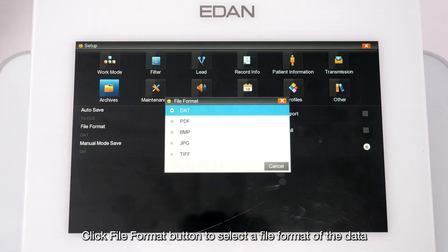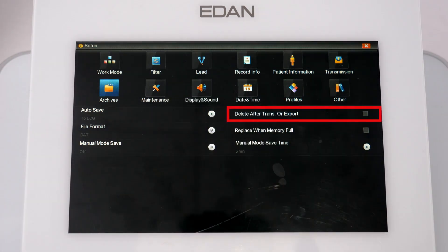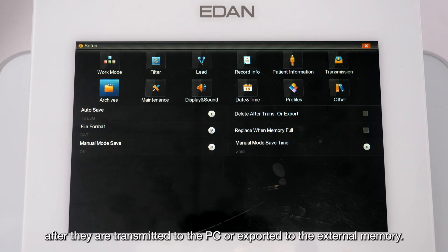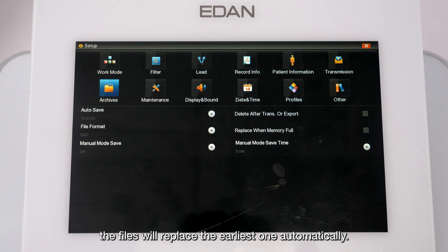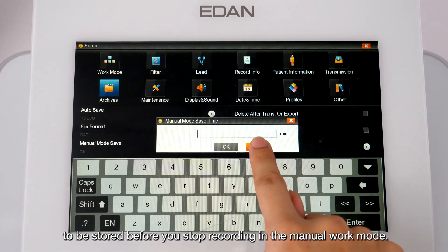Click the File Format button to select a file format for data to be exported or transferred. When Delete After Trans or Export is selected, files will be automatically deleted from the archive screen after being transmitted to a PC or exported to external memory. When Replace When Memory Full is selected, if stored files reach the flash memory limit, the earliest file will be replaced automatically. Tap Manual Mode Save Time to set the length of ECG data to be stored before stopping recording in manual work mode.